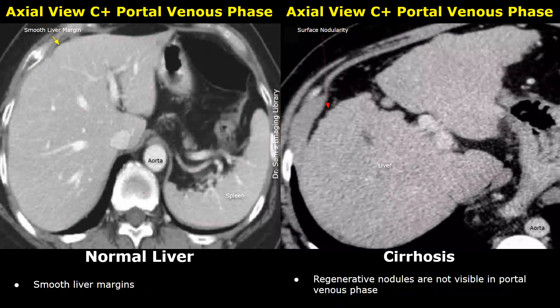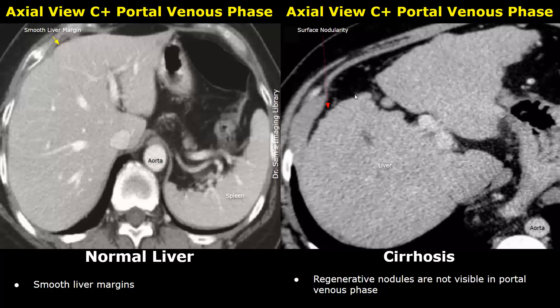The regenerative nodules are not visible during the portal venous phase — we are just seeing the surface nodularity of the liver during this phase. Therefore, regenerative nodules are best visualized on a plain, non-contrast CT.